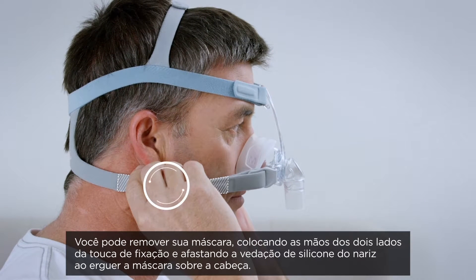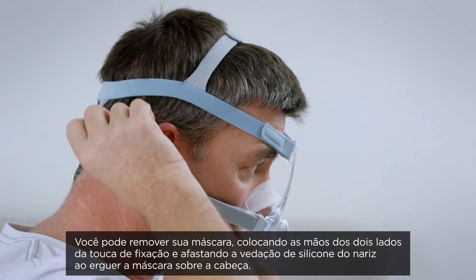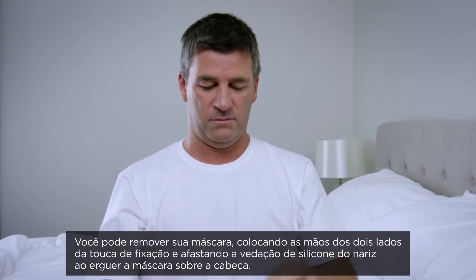You can remove your mask again by placing your hands on either side of the mask frame and pulling the silicone seal off your nose and lifting the mask back over your head.